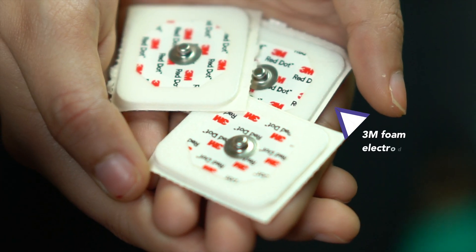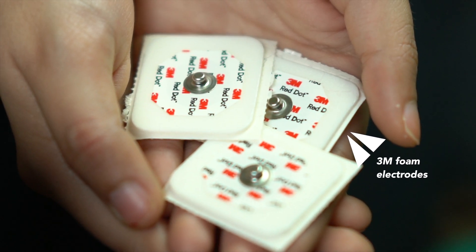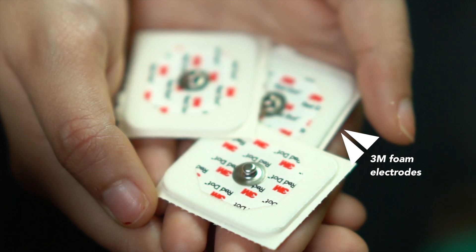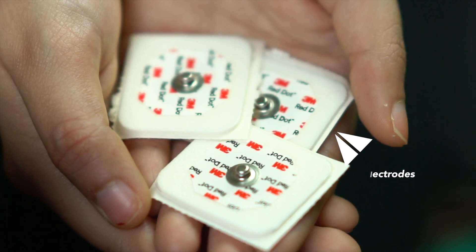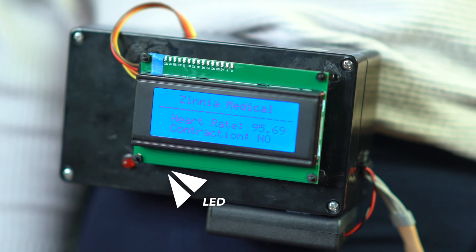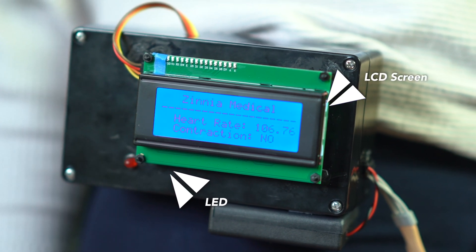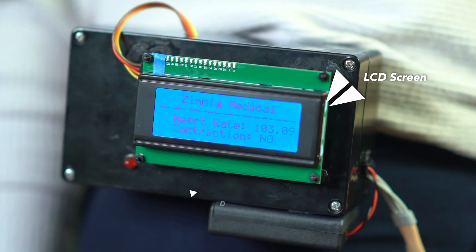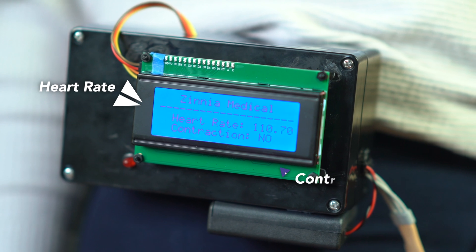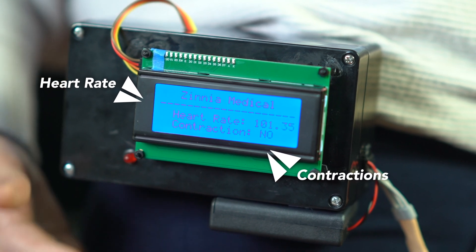The system also includes three foam electrodes to be able to detect the electrical activity of the heart of the baby. The device includes one LED and an LCD screen to display the heart rate readings as well as any contractions that may be detected.